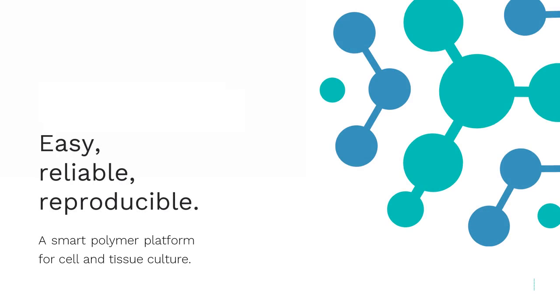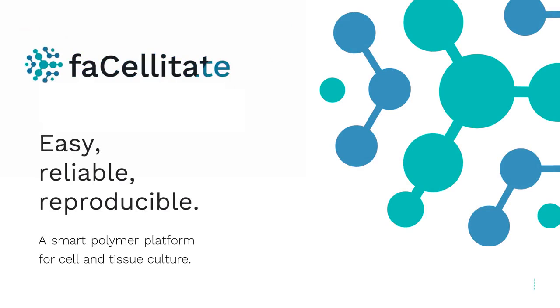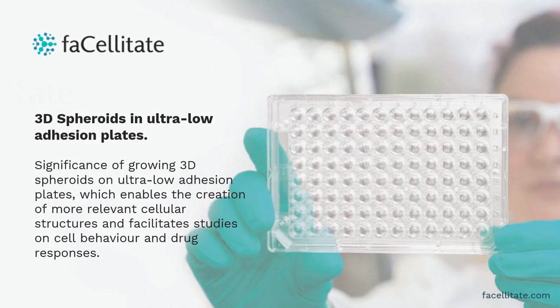Welcome to faCellitate. We want to introduce our smart polymer platform for advanced cell and tissue culture applications. This video is about growing 3D spheroids on ultra-low adhesion plates, which enables the creation of more relevant cellular structures and facilitates studies on cell behavior and drug responses.